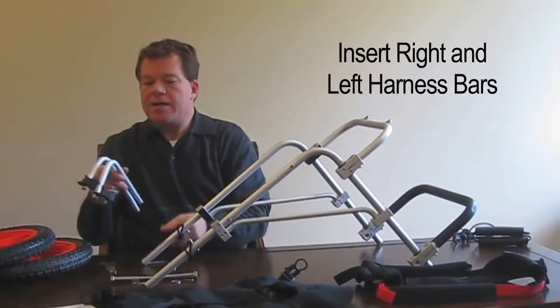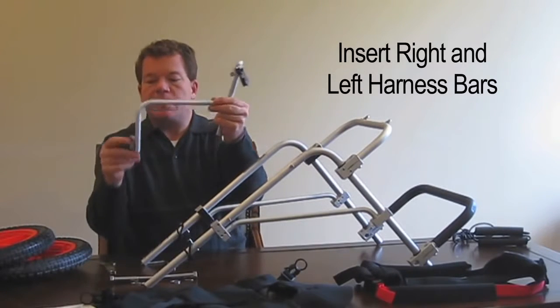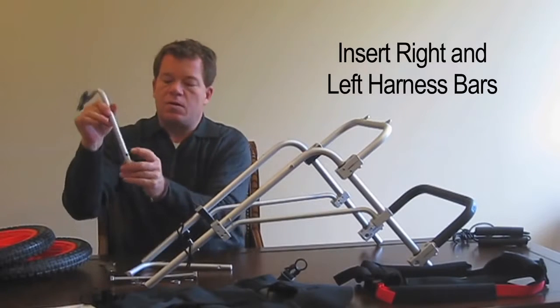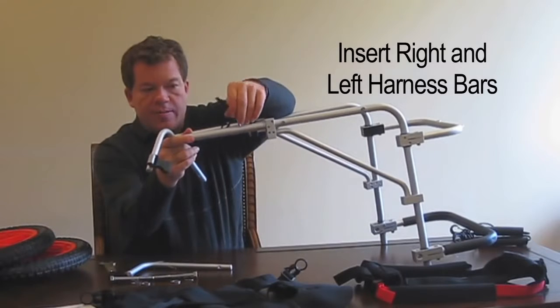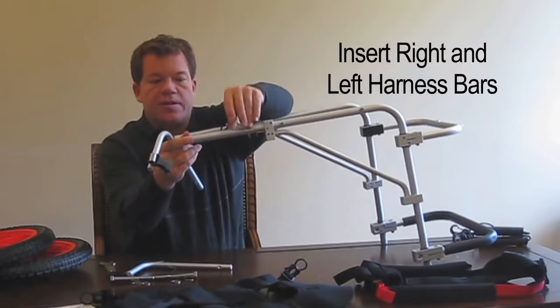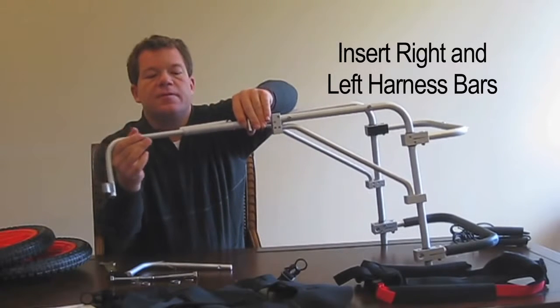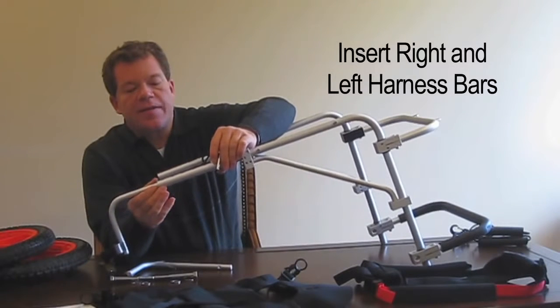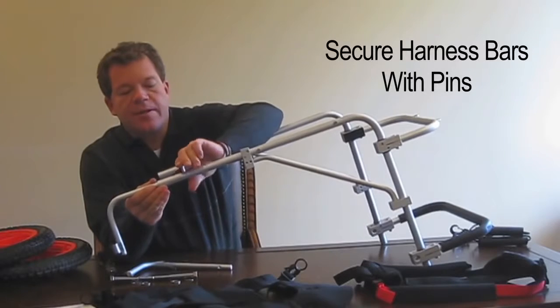Now it's time for the right and left harness bars. They can go on either side — just make sure that the buckle end is down. There's a hole right here. The pins will already be in the unit and this is adjustable — you can adjust it later once you get the dog in it. For right now, just put them in the middle. Line the hole up and then put the pin in.